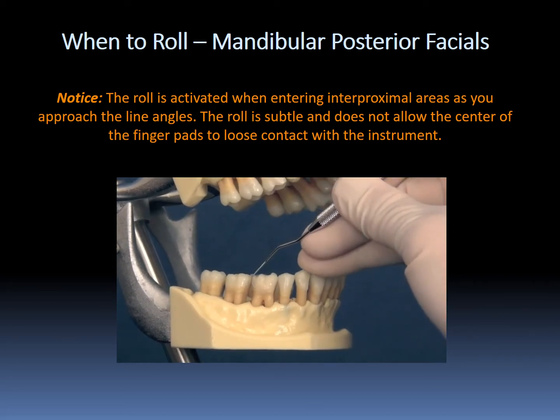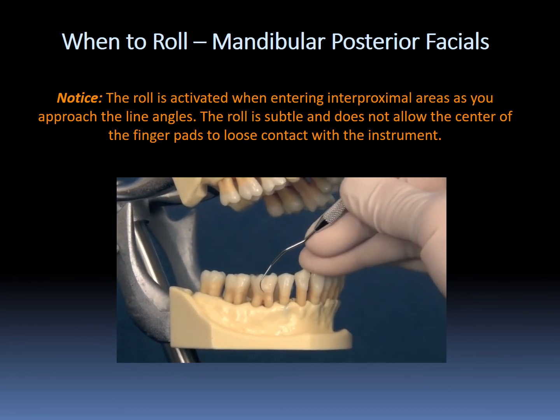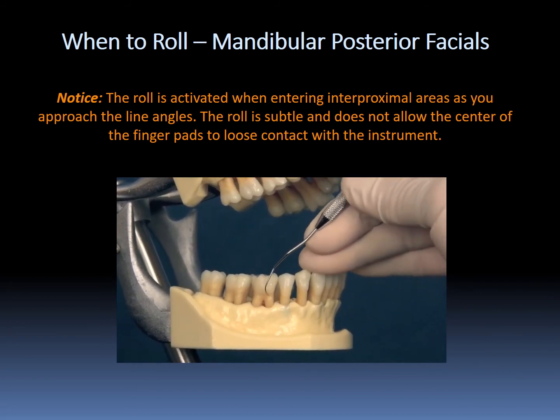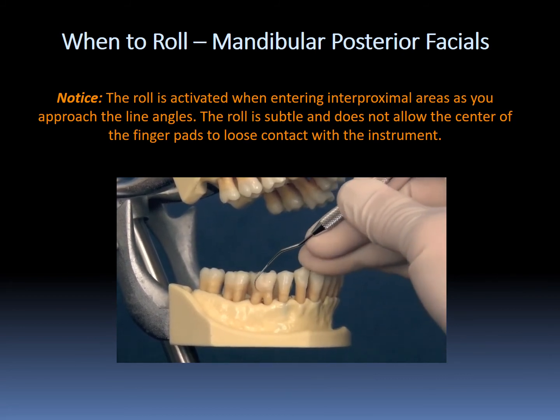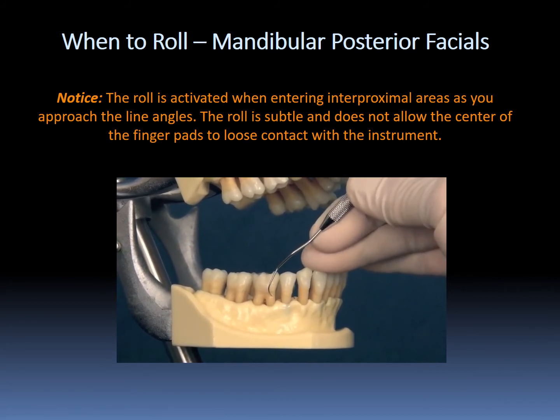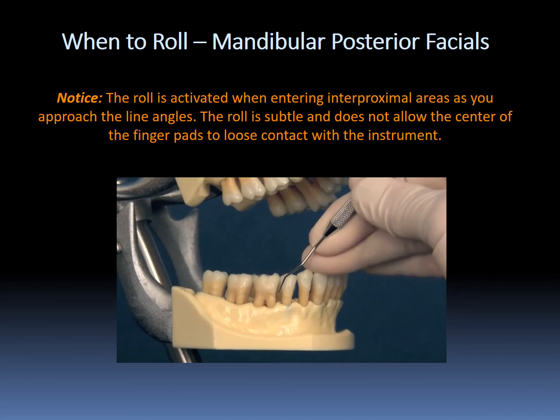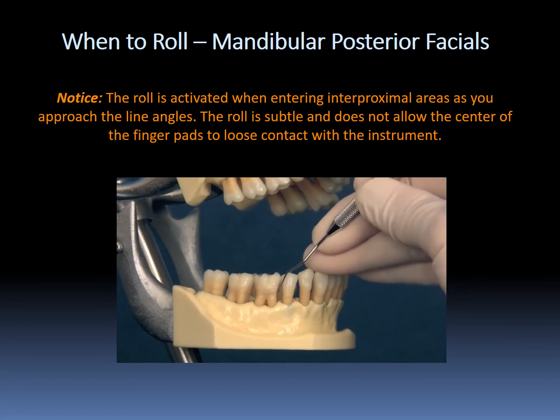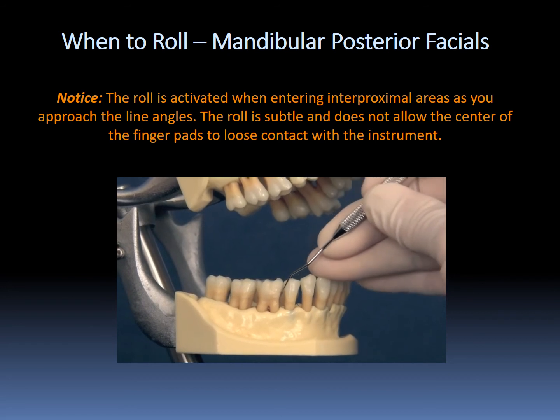And then we're going to pretend on this Typodont to insert it subgingivally, and then we're going to activate very small oblique strokes across the buccal surface. Let's try that again. Insert at the distal line angle and use oblique strokes across the buccal surface. When you get to the mesial line angle, use your thumb to rotate the handle in your fingers. You use the thumb against your middle and your index finger and adapt to the mesial, and then activate vertical or oblique strokes across the mesial.